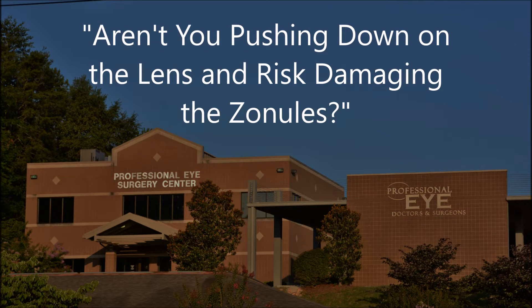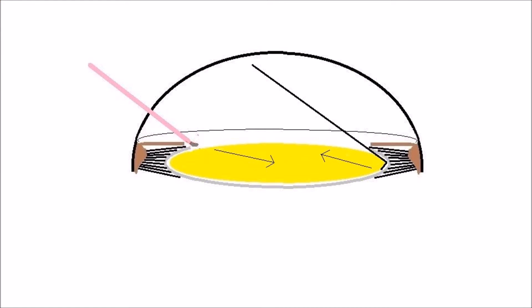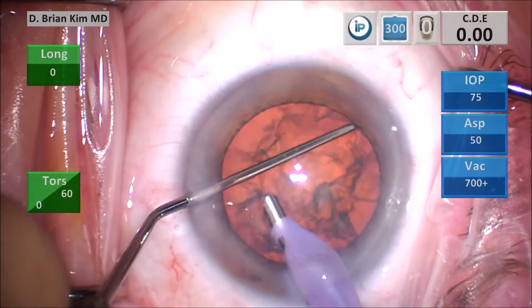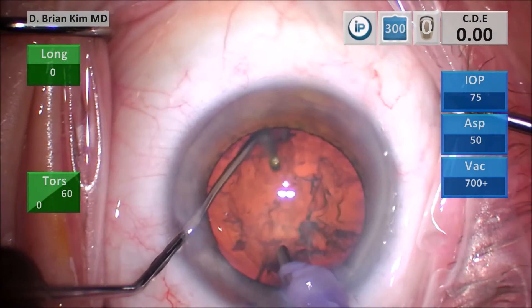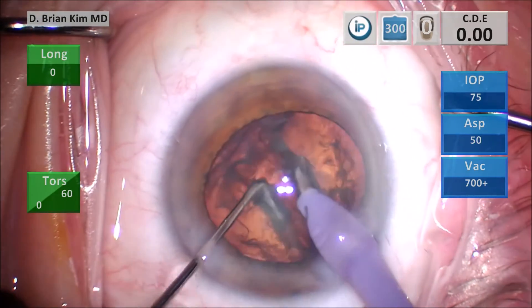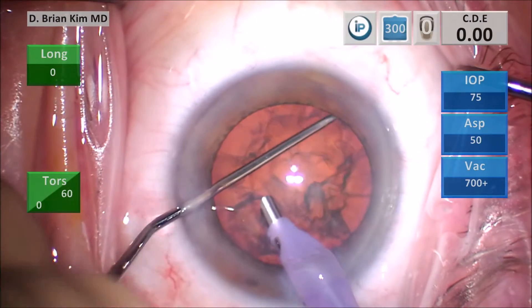Some people are concerned about pushing on the zonules and causing zonular stress. Well, if you look at the schematic, the chopper is placed out to the equator but you can angle it in such a way that you're holding and supporting the lens from below with the chopper, and then you drive the facotip down as the chopper is raised upward. For illustrative purposes I'm going to pull up on the chopper and then push down on the facotip after I lift. I'm going to show this in slow motion.